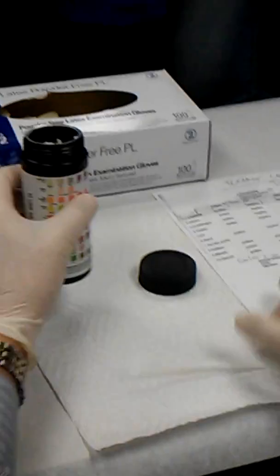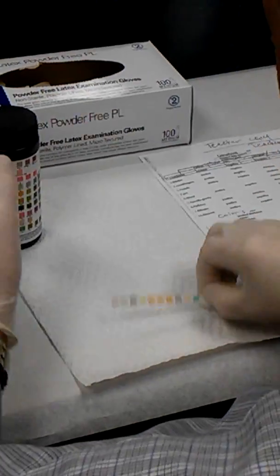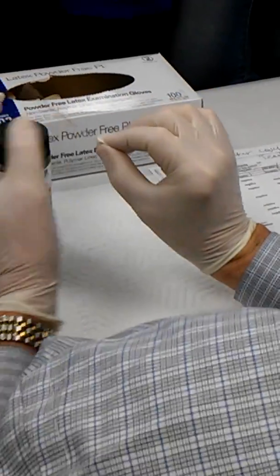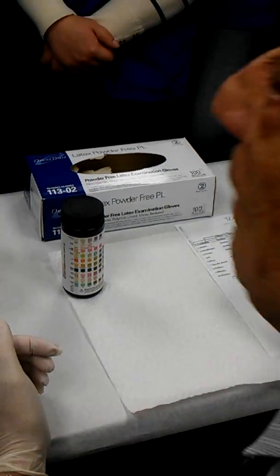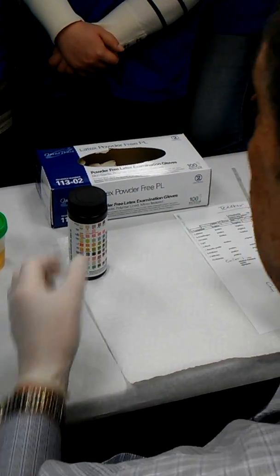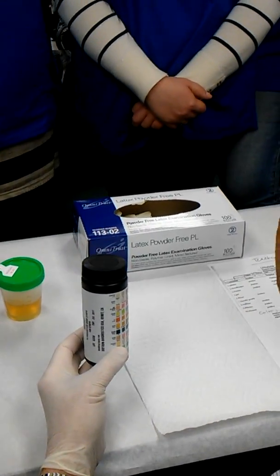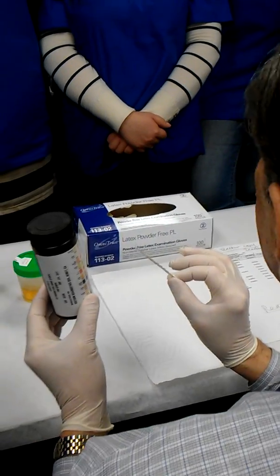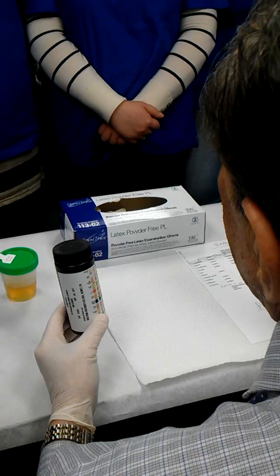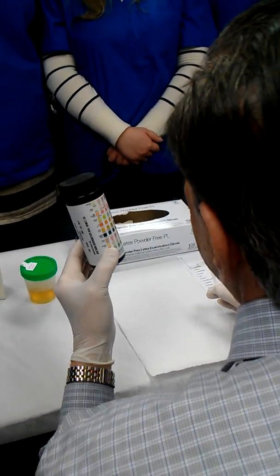So these urine strips will have different colors, right? They will have lines with different colors. Every color is related to a substance in the urine. And you will have a bottle. So these strips belong to this bottle. You don't have to use another bottle with this strip. Only this strip and this bottle. Okay, every time like this.